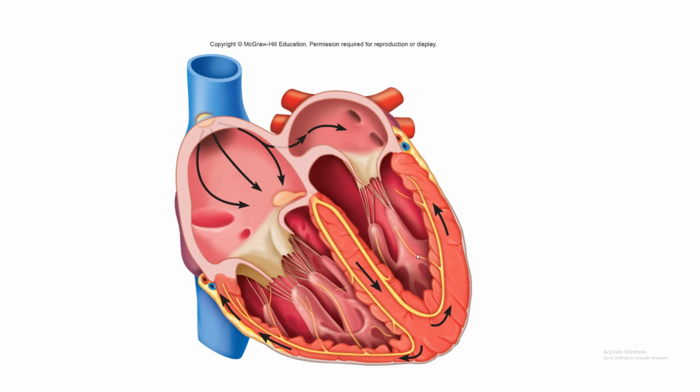And then when you're repolarizing and everything's becoming more negative, that signal is going to be moving back this way, right? This negative signal is going back towards this negative electrode over here, and that's going to give you another upward deflection, right? Positive, you're going to get an upward deflection. Negative, you're also going to get an upward deflection, right? And if it was the opposite, if it was negative to positive, you'd get a downward deflection. Does that make any sense, right?